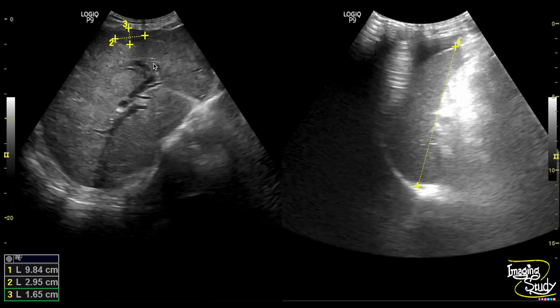Here is the measurement of the hypoechoic lesion we found in segment 4, though other tiny lesions making the liver heterogeneous are not well appreciated here. The spleen appears normal and ascitic fluid is also seen.